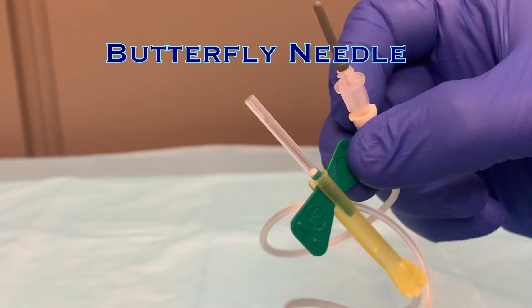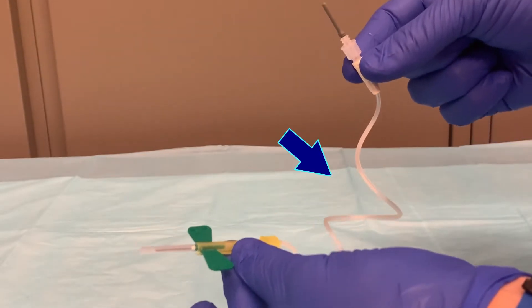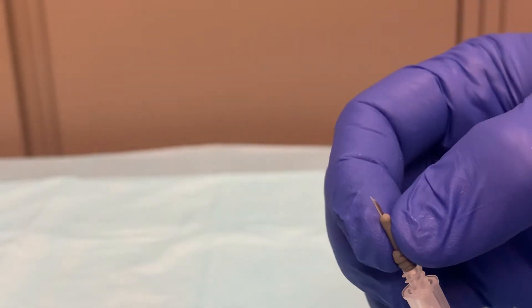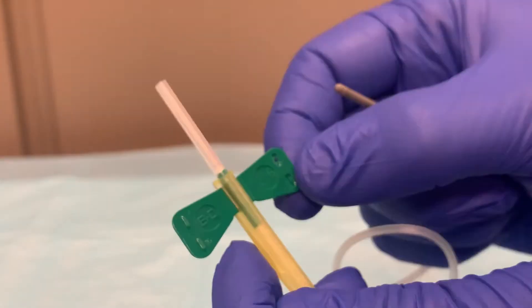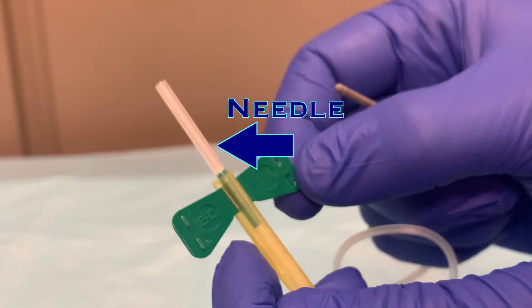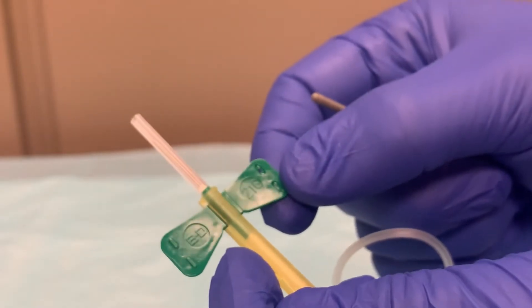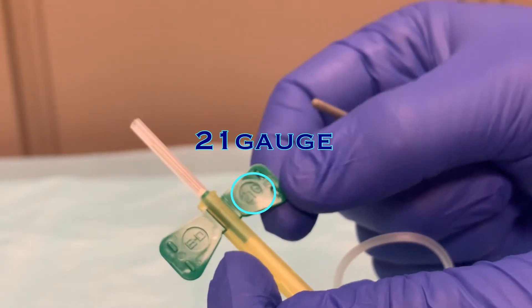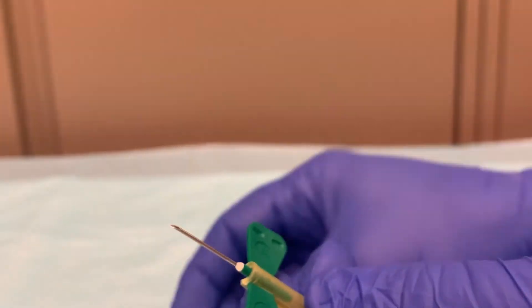Before poking a patient, it's best to understand the supplies that you'll be using. First we'll look at the butterfly needle. At one end is a needle protected in a plastic sheath and attached to some tubing, and at the other end of that length of tubing is a gray rubber nub. That gray rubber conceals and protects a needle — be aware of this, and be careful not to accidentally poke yourself. On the opposite end of the tubing is the butterfly needle itself.